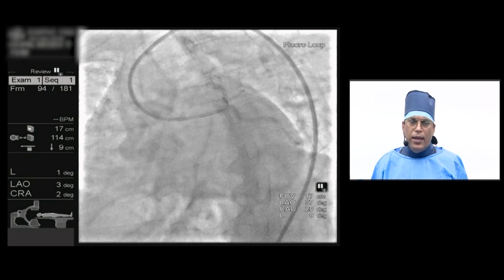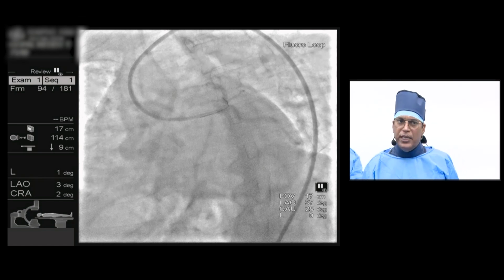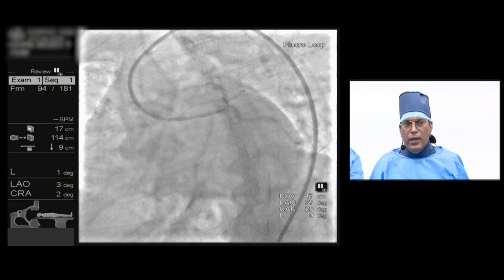Whereas in rota, while doing rota ablation, there will not be any forward flow. But because this orbital moves around the vessel circumference, there is a space in the central portion, so there is forward flow. Because forward flow is there, debris will be cleared on a fast-track basis. So the particle size is smaller, forward flow is maintained, it moves around with a bigger arc of ablation, and it can cut even deep calcium, calcium nodules and eccentric nodules, and you can do it in backward and forward motion. So orbital can be used for the left main ostium.